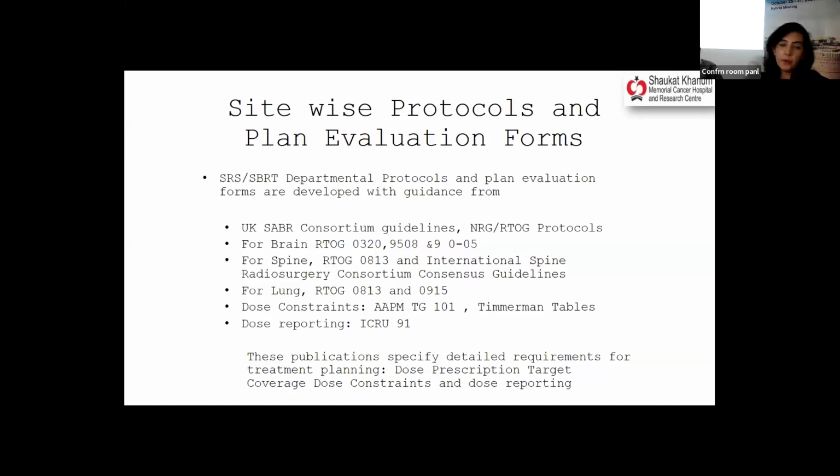And for dose reporting, we use ICRU 91. These publications specify detailed requirements for treatment planning, dose prescription, target dose coverage constraints, and dose reporting.